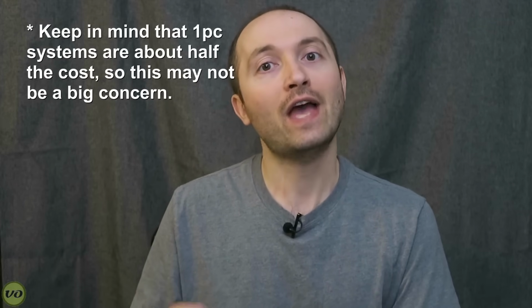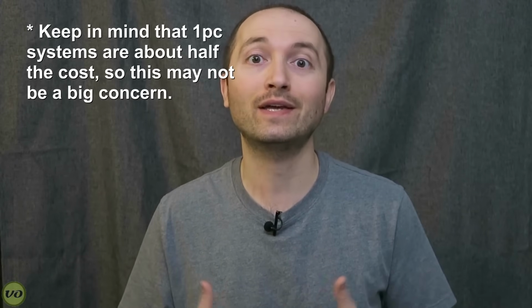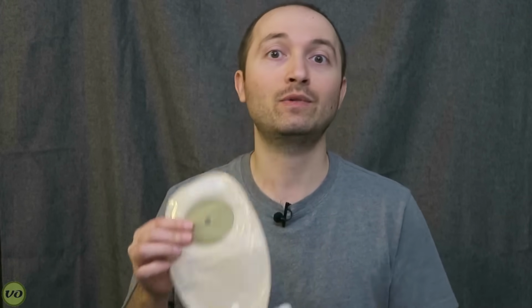In addition to that, if you have to change your appliance early, let's say, for example, you put on a fresh appliance in the morning, and by the afternoon you've got some kind of leak going on, with a one-piece system you have to change the whole appliance. That means your bag goes out with your wafer. That can end up costing a lot of money if you're doing that often. Whereas if you're using a two-piece system, you can just remove the bag, change your wafer, and put that bag back on if everything is still fresh on it, so if the filter isn't clogged and that sort of thing.